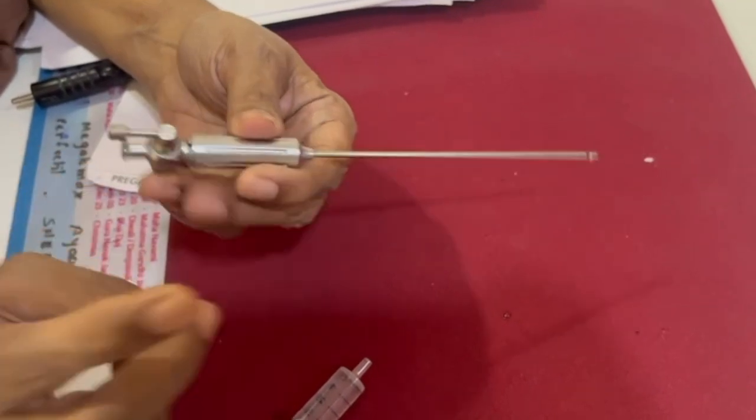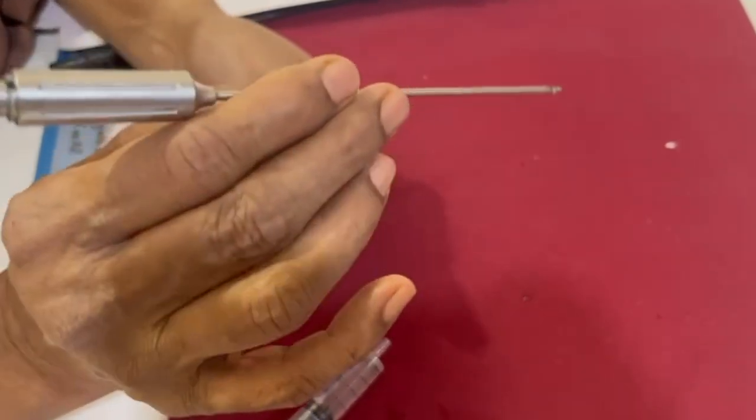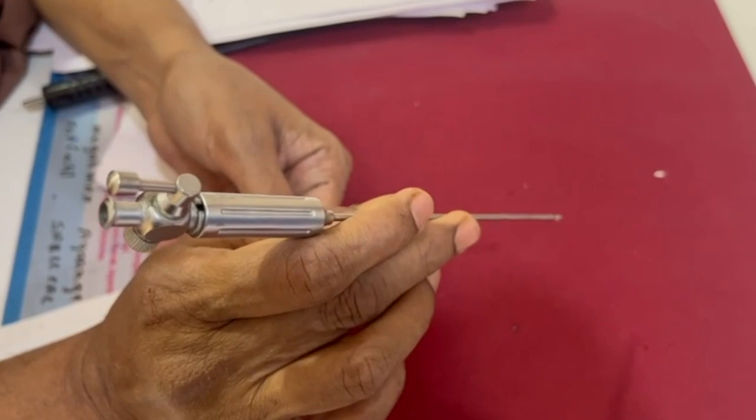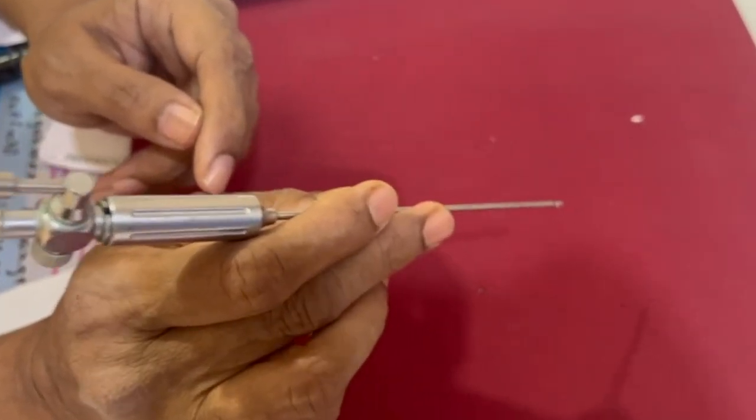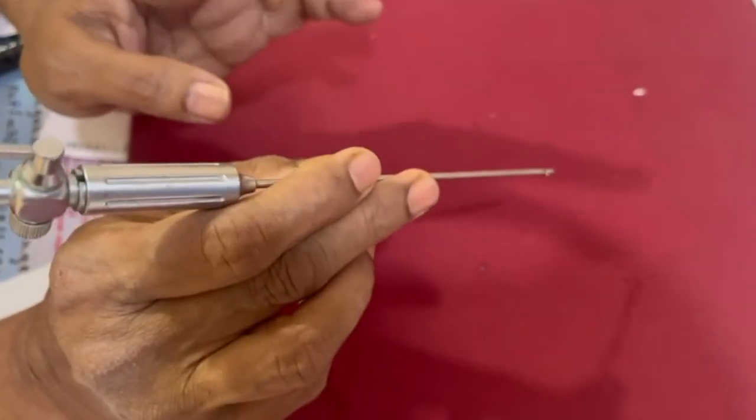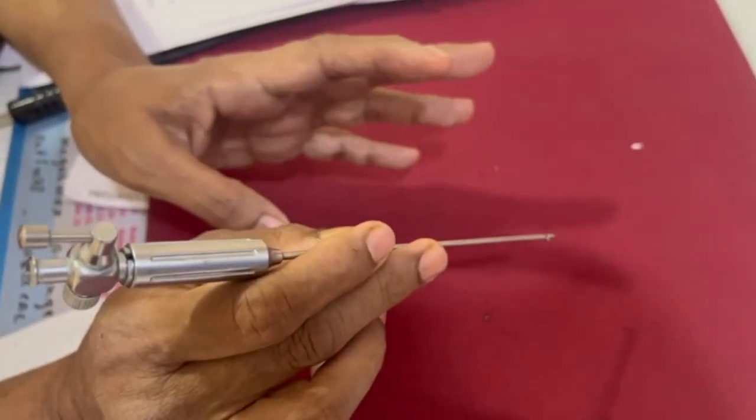There is a double click test. When we pierce the rectus sheath we appreciate one click, and the second click we appreciate when we pierce the peritoneum. That is called the double click test.